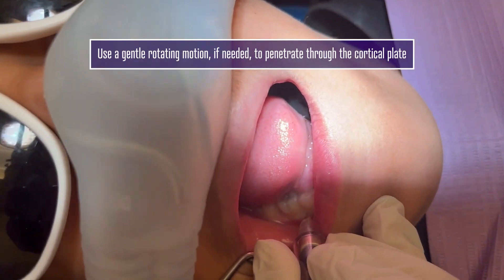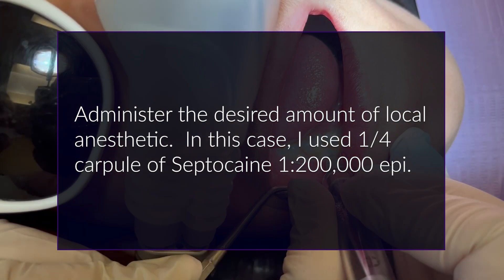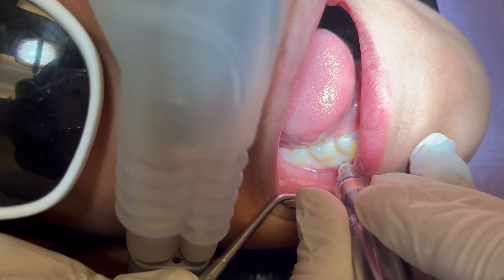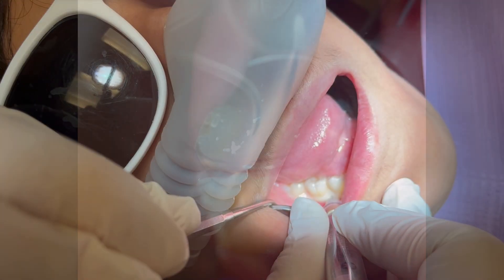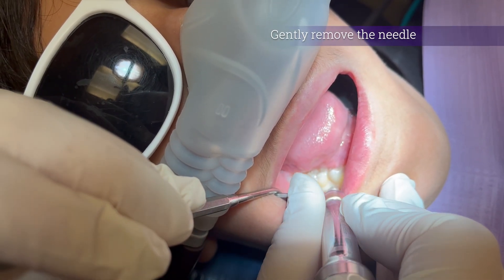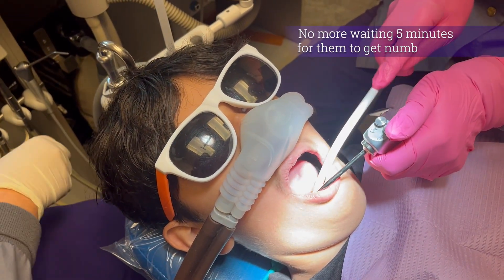Can you see the dots? There's a little bit of pressure. And now I'm going to put it into drive mode so it comes out a little faster. Look at how white the tissue is. I'm going to remove it. I'm going to go straight to the dry shield.